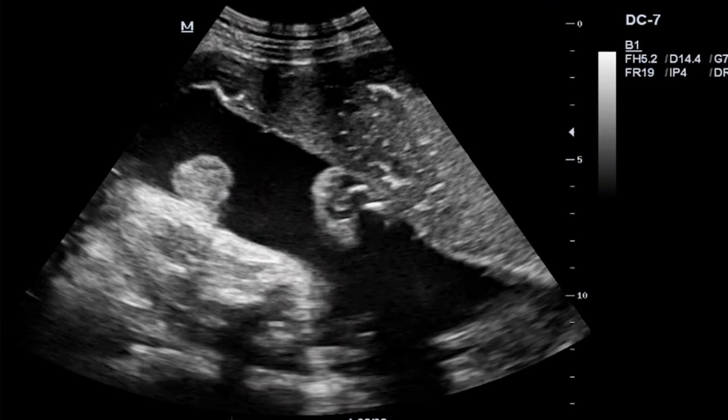Some people have an illusion that maybe it's the machine that actually predicts the sex of a fetus, of which it is the practitioner, the clinician, who upon scanning is the one who can then say this is a male or a female fetus. So fetal sex determination is a skill that is acquired by practitioners.